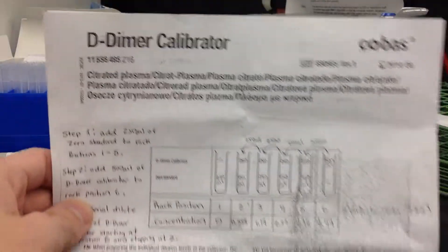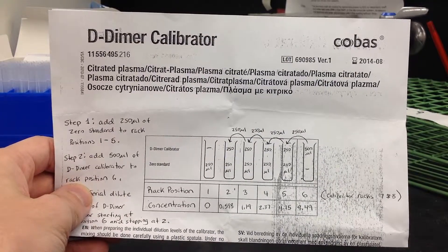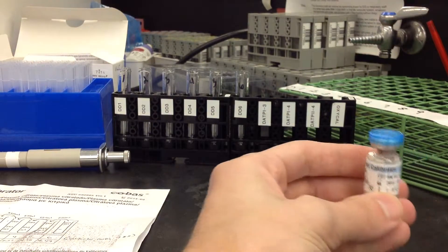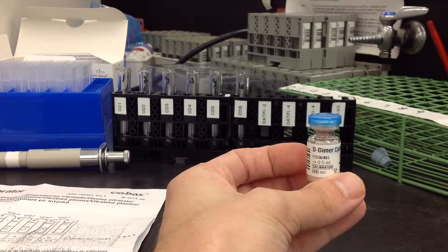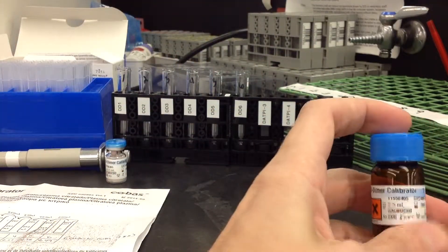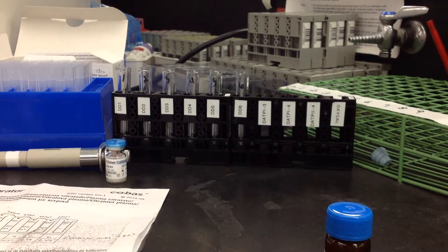I'm going to use the guide that I made to help us do this, so that it's left to right as far as the dilution goes. First, you would need to reconstitute your calibrator with 0.5 mLs of DI water, and I think it takes about half an hour before you want to use it. And then you actually have the D-dimer Calibrator 1, which is what the zero standard is on the guide.